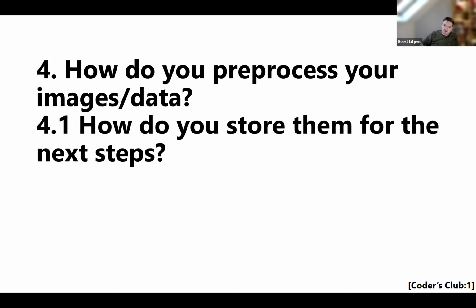In terms of preprocessing for experiments, for first initial experiments, just to see what kind of numbers you can get, what we would generally do is directly train on the slides, which means that you just extract patches on the fly using multiprocessing, etc., with your favorite data augmentation library. And then once you want to get really into hyperparameter optimization, I have most experience with TensorFlow, but I'm 100% sure that PyTorch has a similar pipeline.